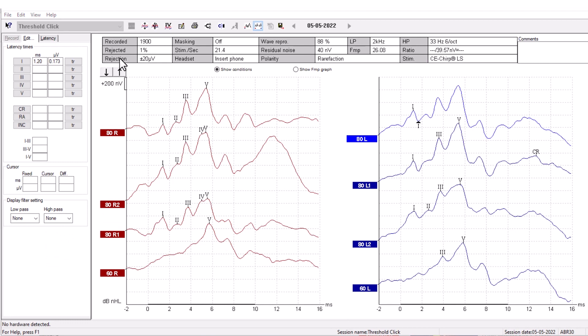At the top of the screen, you can see an overview of the different recording parameters used for the chosen waveform.